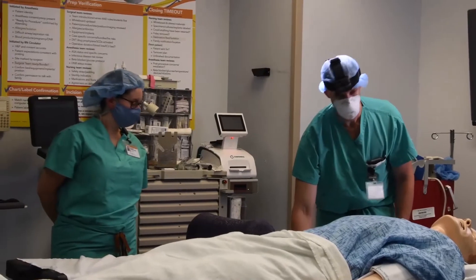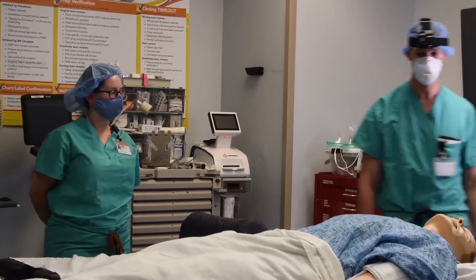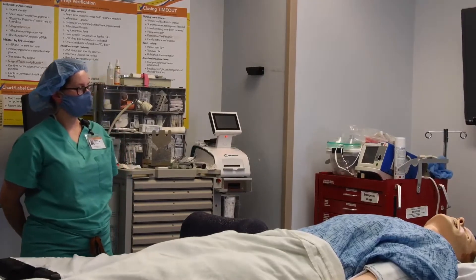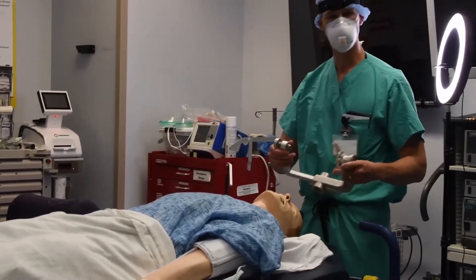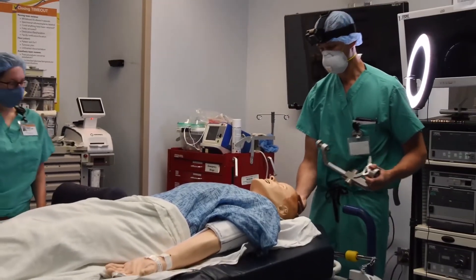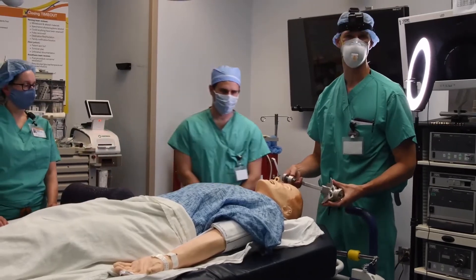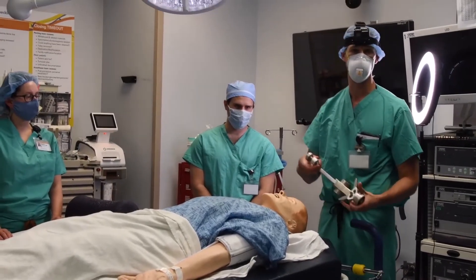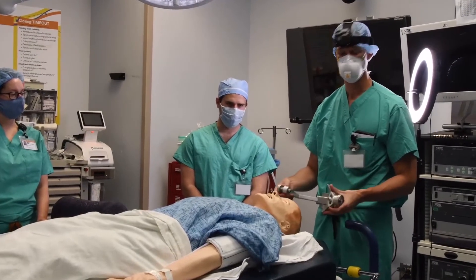You'll frequently pin before you go prone for either position, so we're going to assume our patient's already intubated. We're going to get our Mayfield pens, and when doing this it's really just preference on which side the two and one go on. You want to make sure the patient is looking straight up and down. Pin positioning is very important because it's easy to get into very thin temporal bone if you're not paying attention and cause a skull fracture or an epidural hematoma.